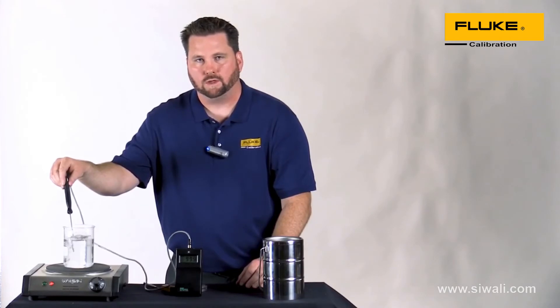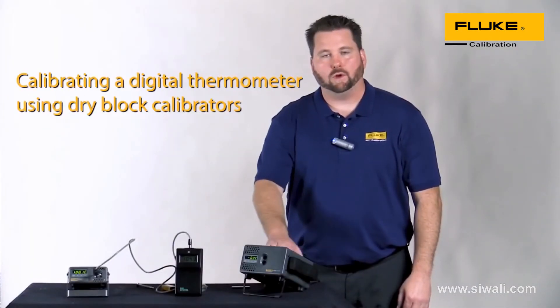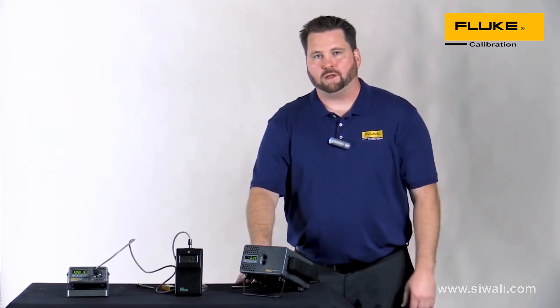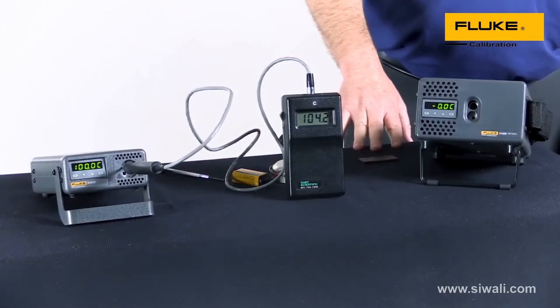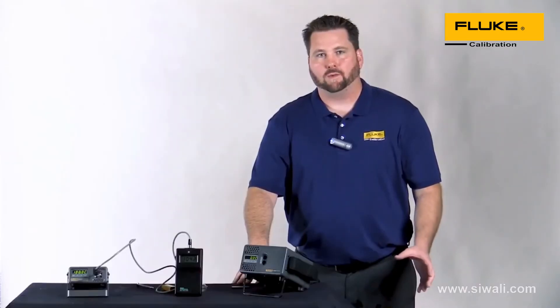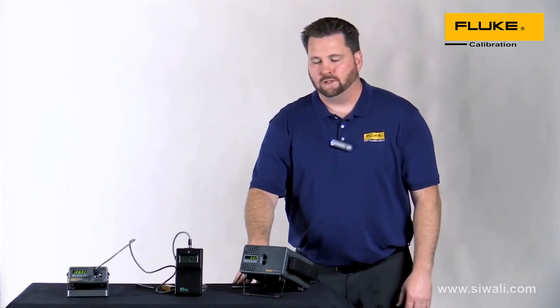Now we're going to use the 9100S and the 9102S to see how we compare. Just a few seconds ago you saw me make the adjustments using the water method, but now you can see we're a little bit out of spec. Those common methods can net you errors in the neighborhood of several degrees.